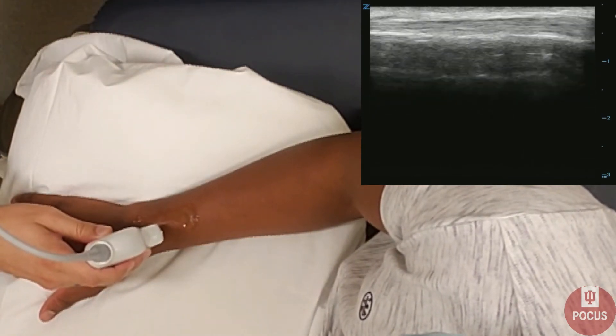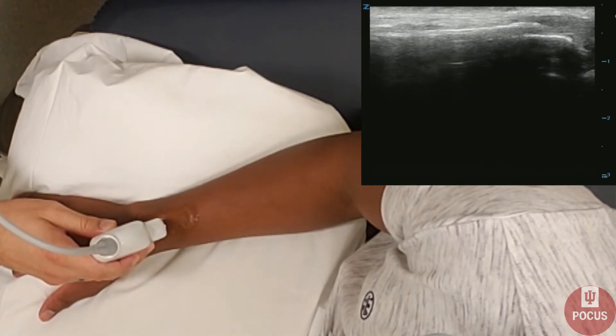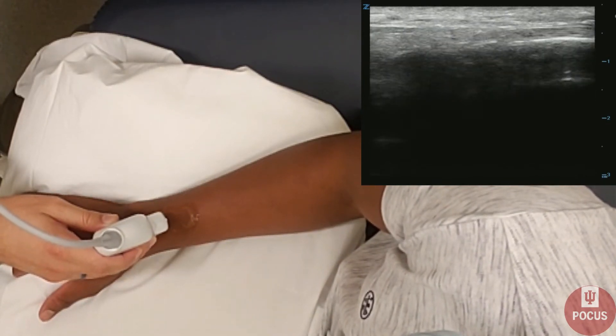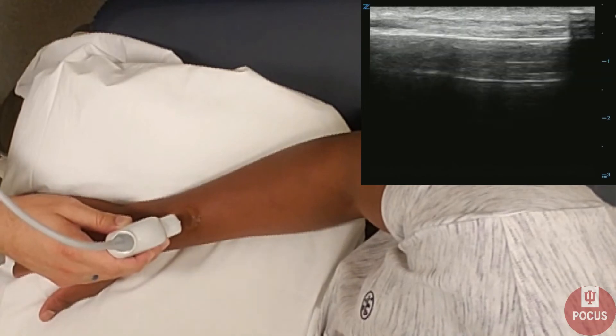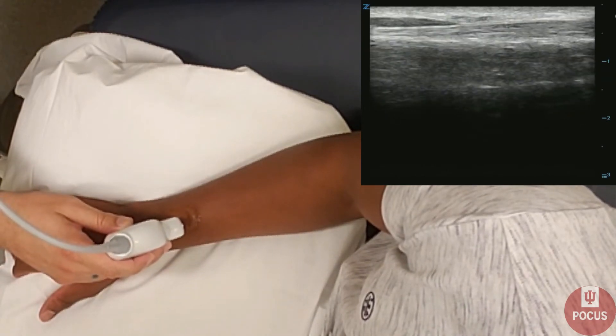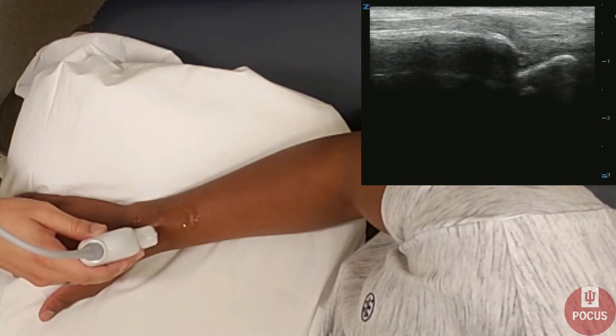Then we'll look at the radius on long axis. We can scan both back and forth and up and down, looking for any signs of cortical disruption signifying a fracture.